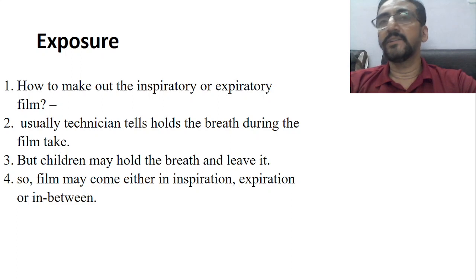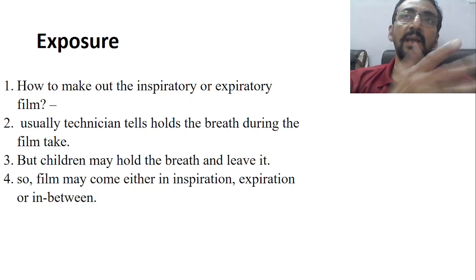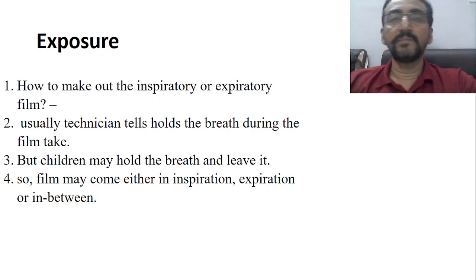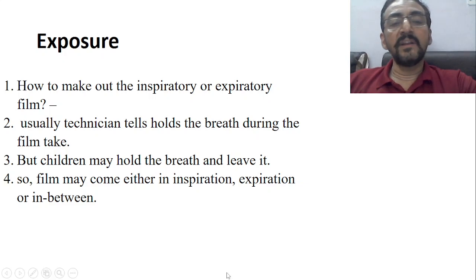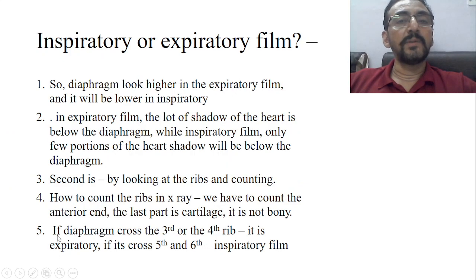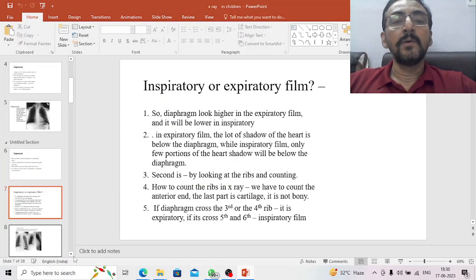So while taking the chest X-ray, the technician will say take a deep breath and then hold it. When you're holding, he will take the X-ray. That means during the inspiration you're holding, your whole chest is extended. So the film may be taken either in inspiration or expiration, because a baby sometimes may not follow any command. Okay, now how to find out?